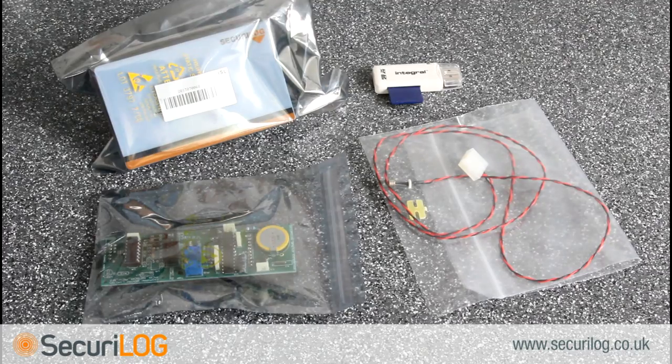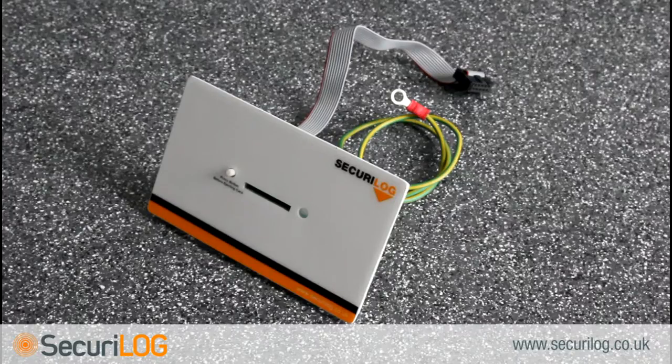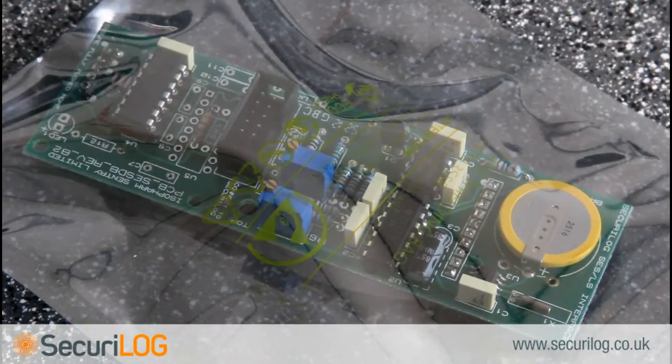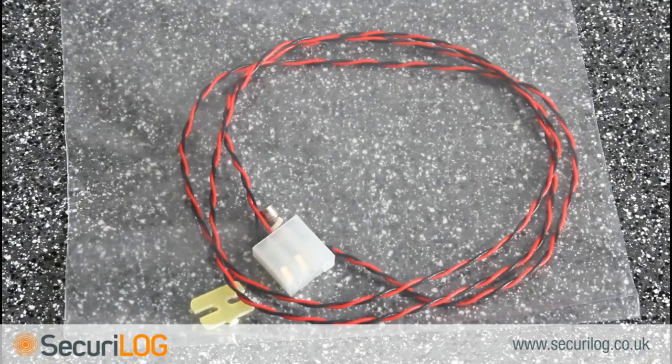The Secure log kit 7X contains a panel mount Secure log with ribbon cable, a memory card and adapter, an isopharm daughter board, and a secondary temperature sensor and H clip.